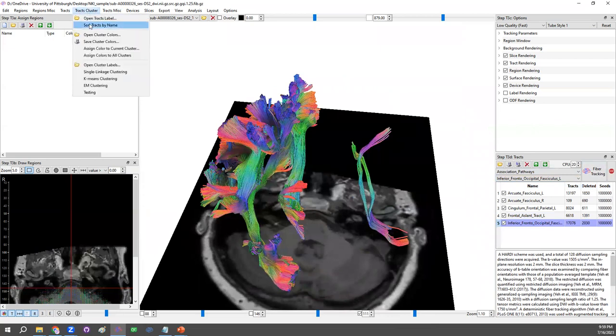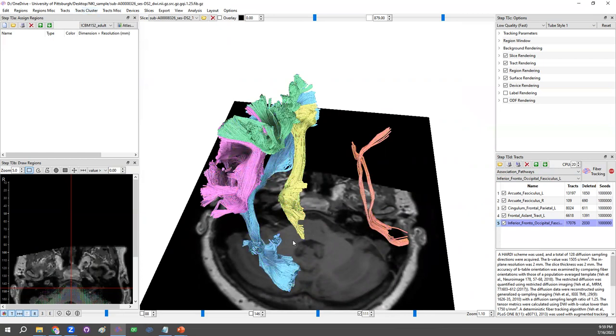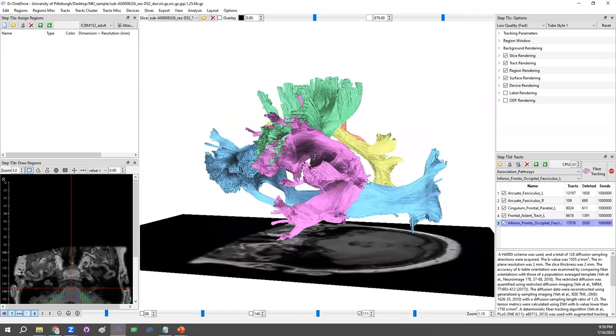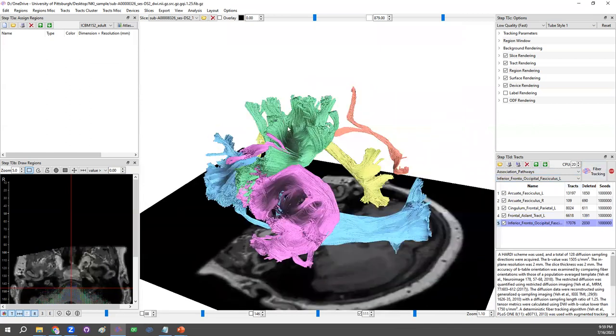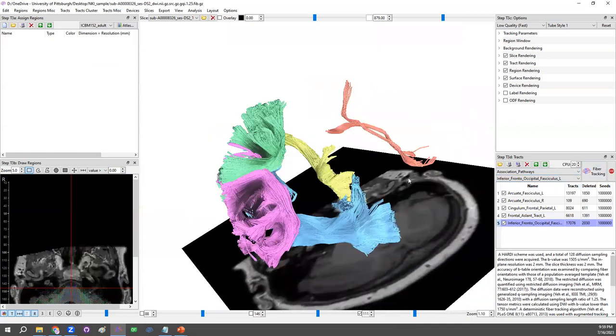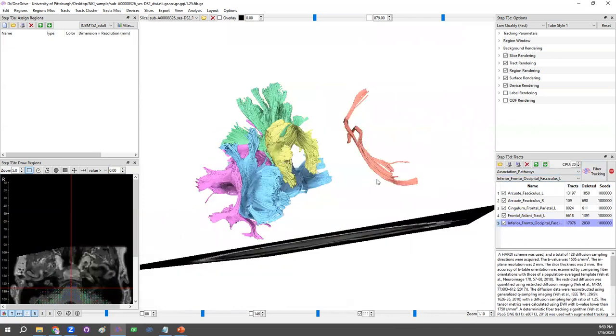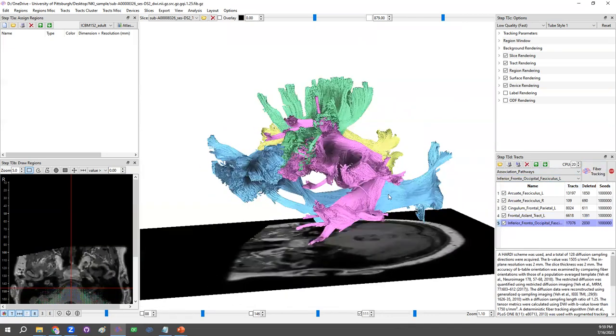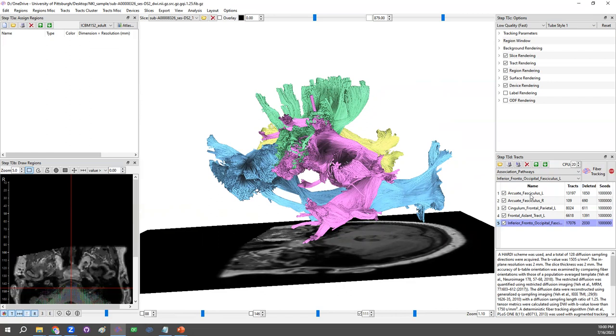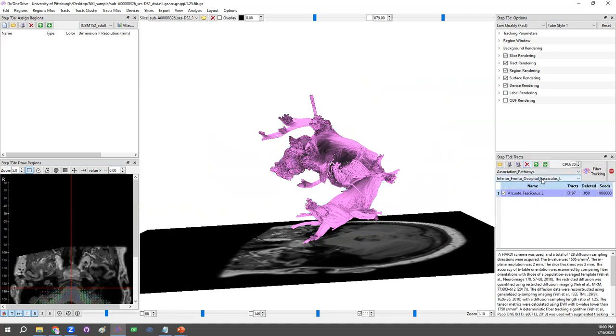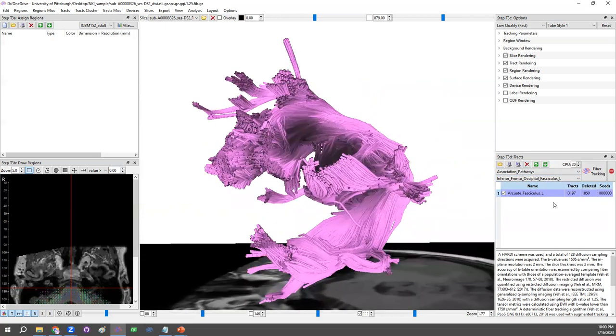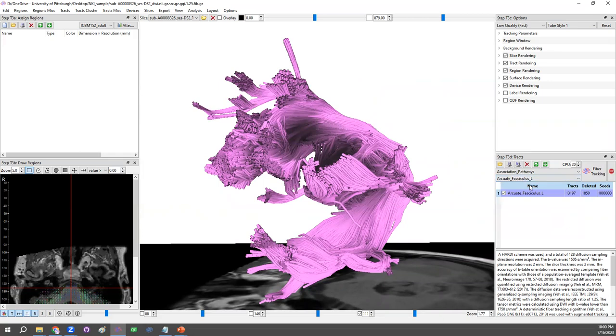And here we could assign different color to help us to tell which pathway belongs to which. So this one, arcuate fasciculus, IFOF, frontal aslant, cingulum. So this would be individual mapping. And you may wonder what the group average mapping looks like here. So to get group average mapping, say for example, for the arcuate fasciculus at the left side. And we may sometimes wonder how does it look different with the group average.